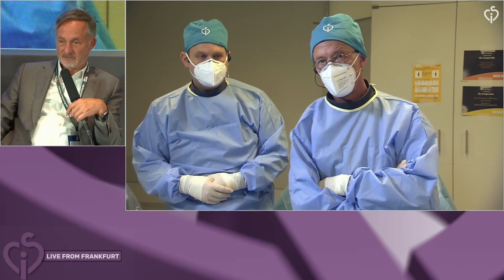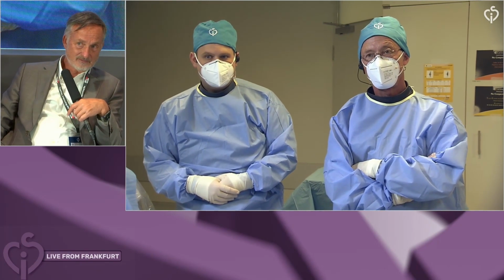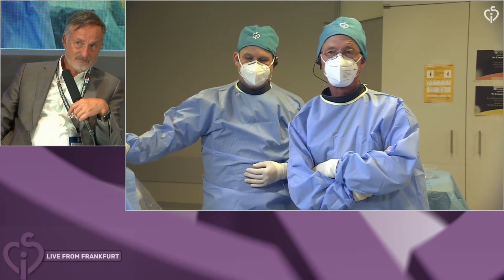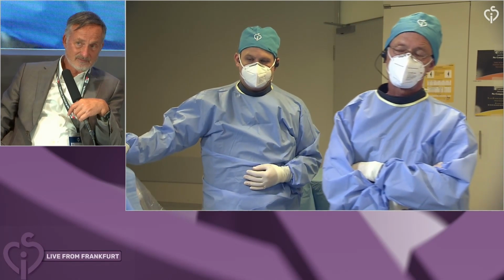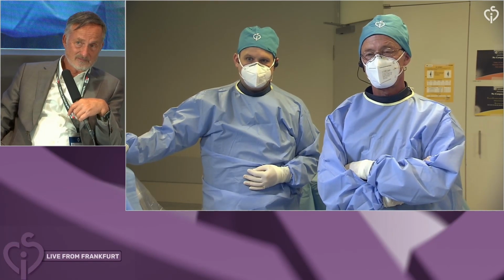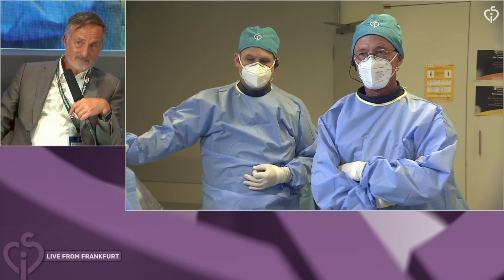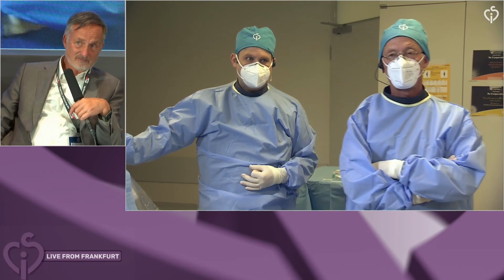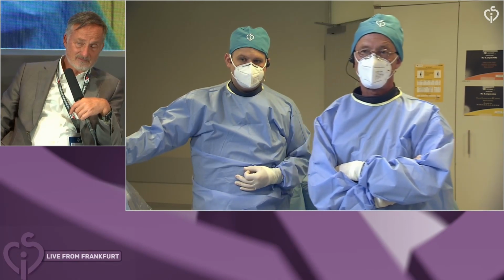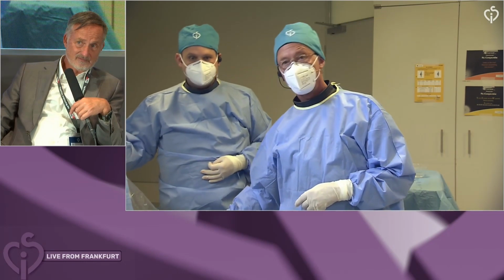If you don't mind, please use the microphone. Surgery. What concerns me in such cases of a hypermobile septum is a late erosion of the septum primum, just behind the discs. Perhaps in such a case, I should have selected a symmetric 25-25 to give more stability, perhaps. I'm asking because you have a lot of accumulated experience between all of us, just for me to be sure that such cases are not going to have an erosion several months after.